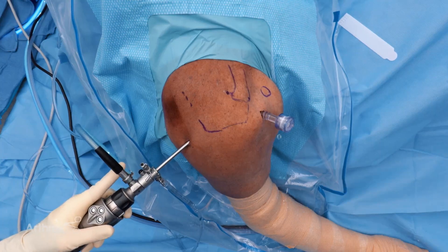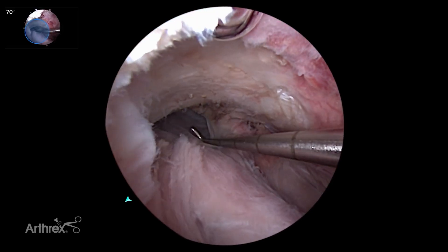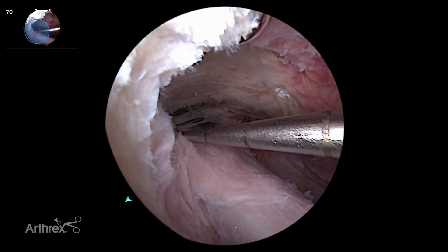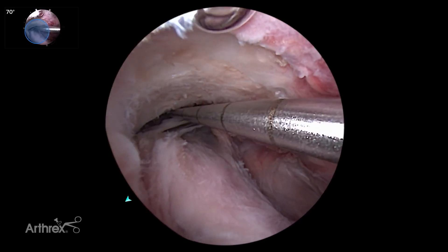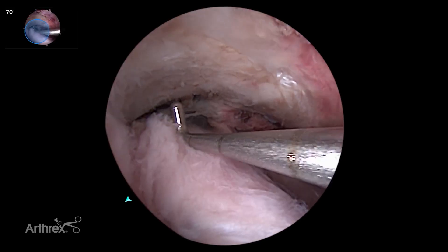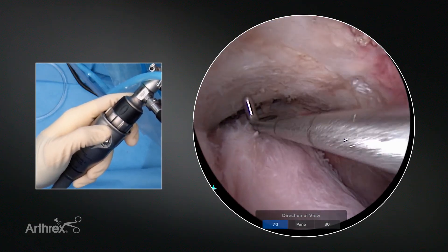Today we're demonstrating the new Synergy Panascope, which allows us to scroll through a 30-degree optic, a 45-degree wider optic, and then a 70-degree optic. We're in 70-degree mode here and I've cleared out the base of the coracoid. It's really apparent how much our visualization can improve with the 70-degree scope. Here's the coracoid base and coracoid tip. It's very rare that we can get all of this in one picture, but it really gives you a sense of how far to get medial and how far to get lateral. You want to be close to your base, obviously not close to the tip, and I can do this by just hitting a button and scrolling from 30-degree to the Panascope to the 70-degree scope, which gives you tremendous versatility.